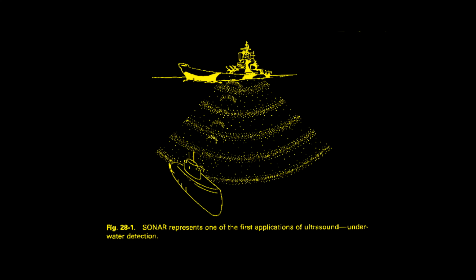So here's a little cartoon about sonar back in the day. You can see there's a ship on the top of the water, and on the bottom of the ship, somewhere in the hull, it had an ultrasound transducer. When they wanted to, it would send out a wave or a volley of sound into the water underneath it. That sound would propagate into the ocean as it got deeper and deeper. So it would send out these sound waves, and between the sound waves, there was no sound. So it would have a ping like ding, ding, ding, and you would see these sound waves coming out.